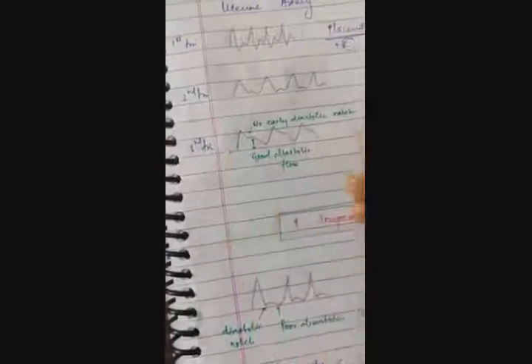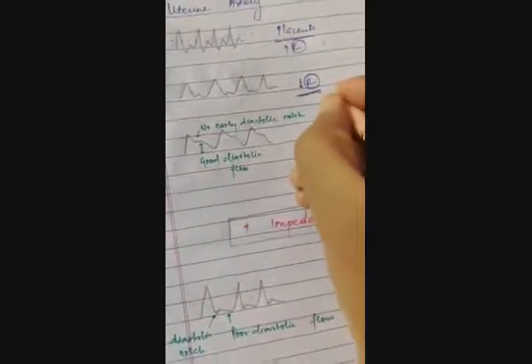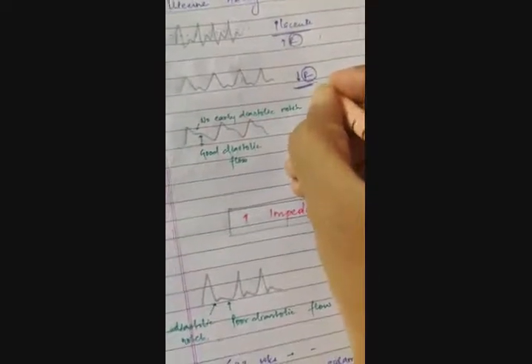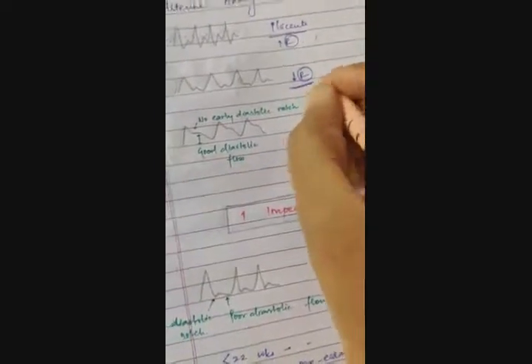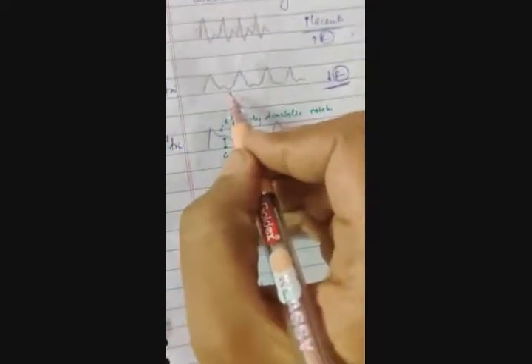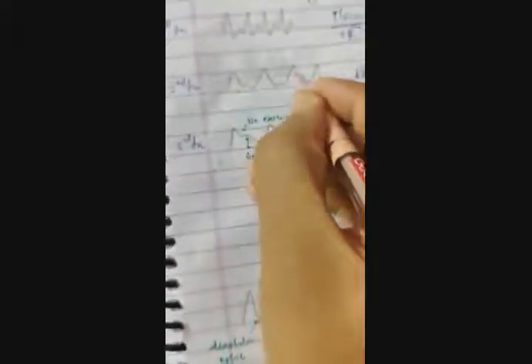Coming to the second trimester, when our uteroplacental flow is well developed, and because we need to increase the circulation, increase the blood flow to the uterine artery, the resistance in the placental circuit also decreases. What you notice here is not a triphasic waveform. You could call it biphasic maybe. And nowhere is the diastole going beneath the baseline. Alright. The mean blood flow would be somewhere here.